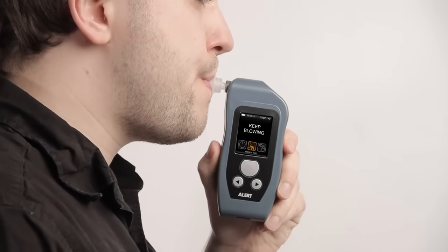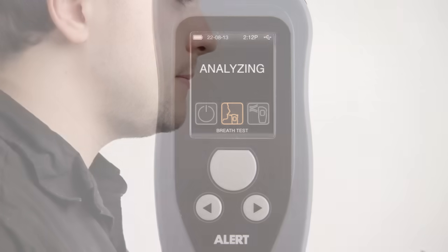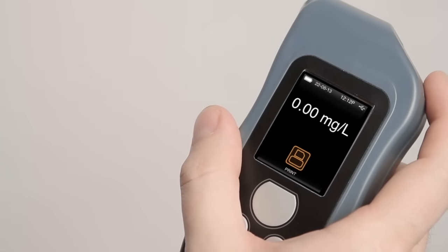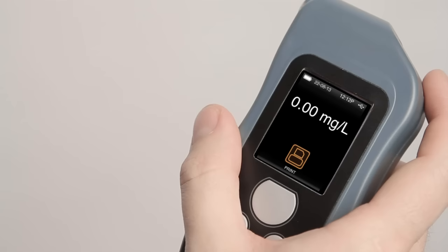A continuous tone will indicate proper breath flow. Continue blowing until the tone ends. Analyzing is displayed for a few seconds, followed by the numeric BRAC result and the Print icon on the display. If the printer is on and paired, select this icon to print the results immediately.